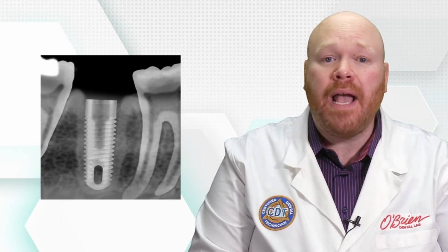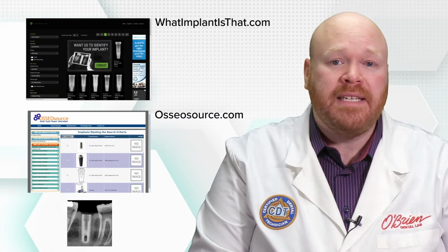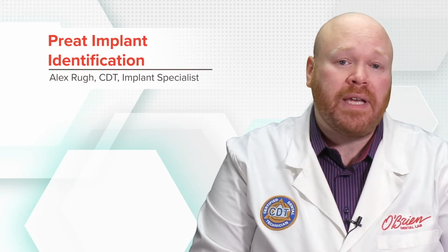In a previous video, we showed you the best way to take x-rays and other images to be able to identify unknown dental implants. And we also talked about OsseoSource and whatimplantisthat.com, which are both implant identification databases. In this video, I want to highlight an additional resource that is now available for implant identification.